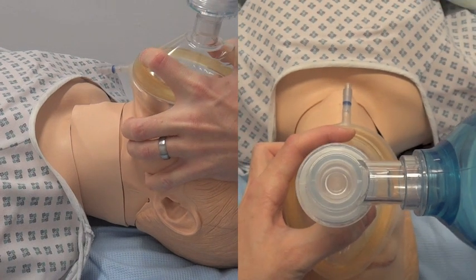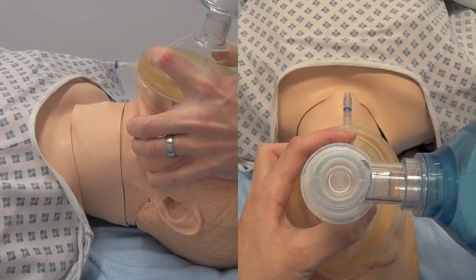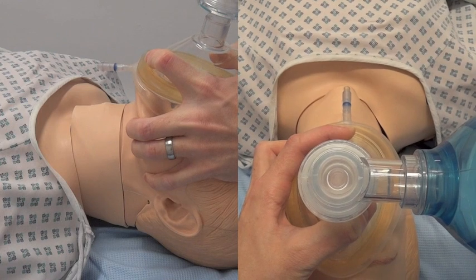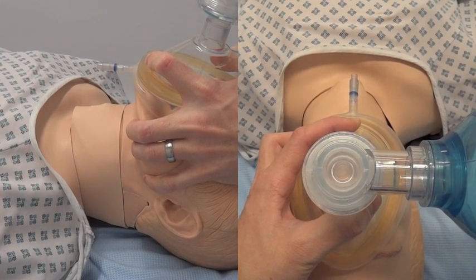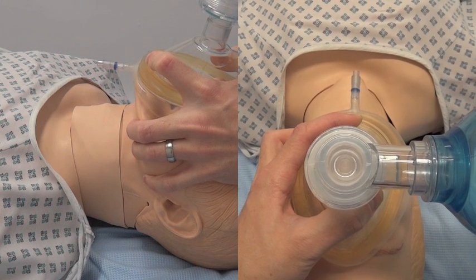Using your other hand, squeeze the bag and you should observe the chest rise and fall. If this is not the case, try repositioning the mask and/or your hands and try again.